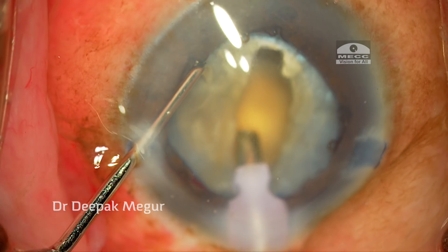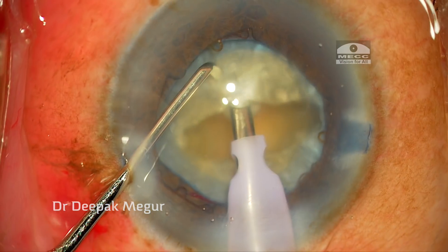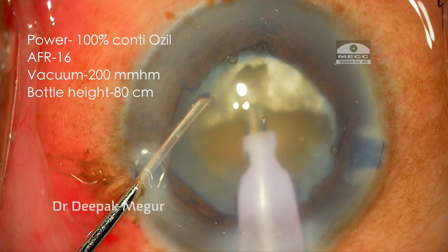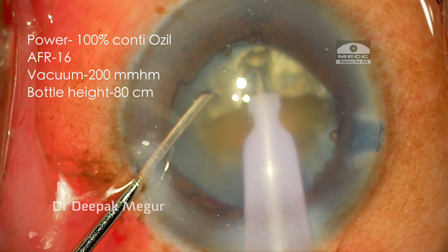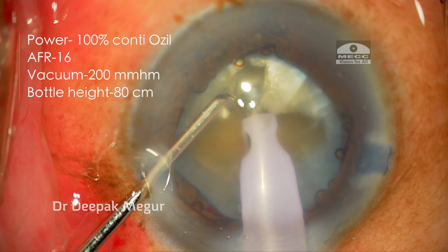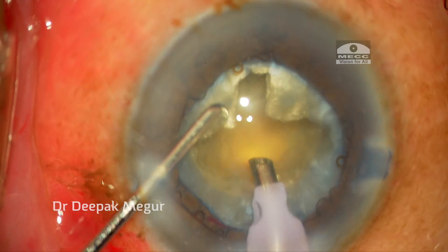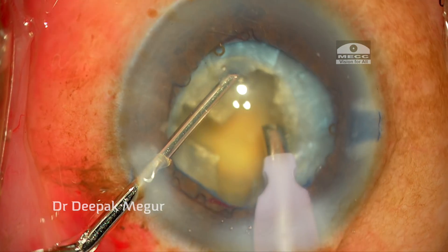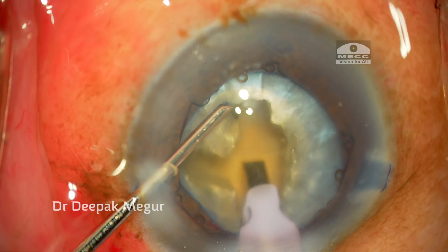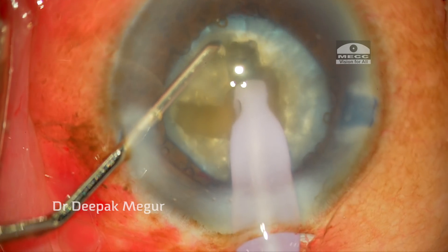While trenching and sculpting, I am using maximum power to stabilize the nucleus and just shave it rather than push at it. We should literally see the nucleus in front of the tip just melt down — this is the best way to core the nucleus without inducing any stress on the zonules. I stabilize the lens with the left hand and perform sculpting by manual rotation.